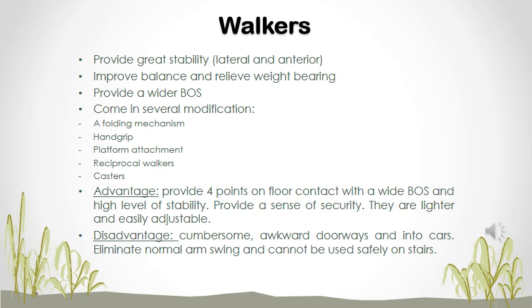A folding mechanism where you can fold it up, store it, place it in a car or a taxi, hand grips, platform attachments, reciprocal walkers, casters, stair climbing walkers. There are many different types of walkers that you can find. But normally, climbing stairs with walkers is not easy and not possible.